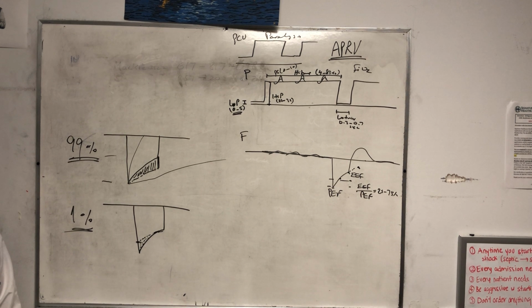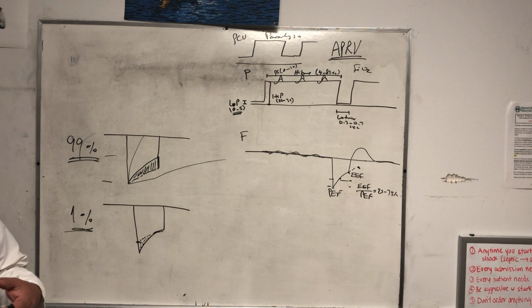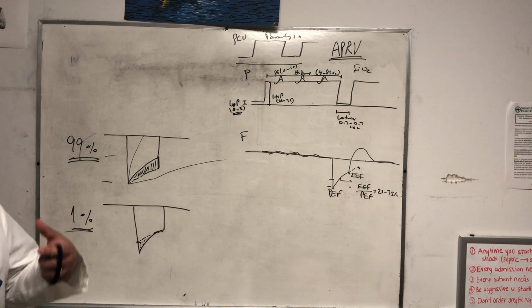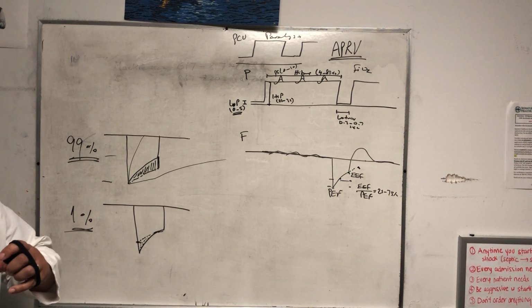If you talk to any pulmonologist, he'll tell you that one of the ways we treat bronchospasm in status asthmaticus, if everything else fails, is PEEP. PEEP is a bronchodilator because it just stents the smaller airway open, even if the small airway wants to collapse, because acetylcholine and troponin and everything is working inside the cell to make it spasm. This thing is stenting it open like this.